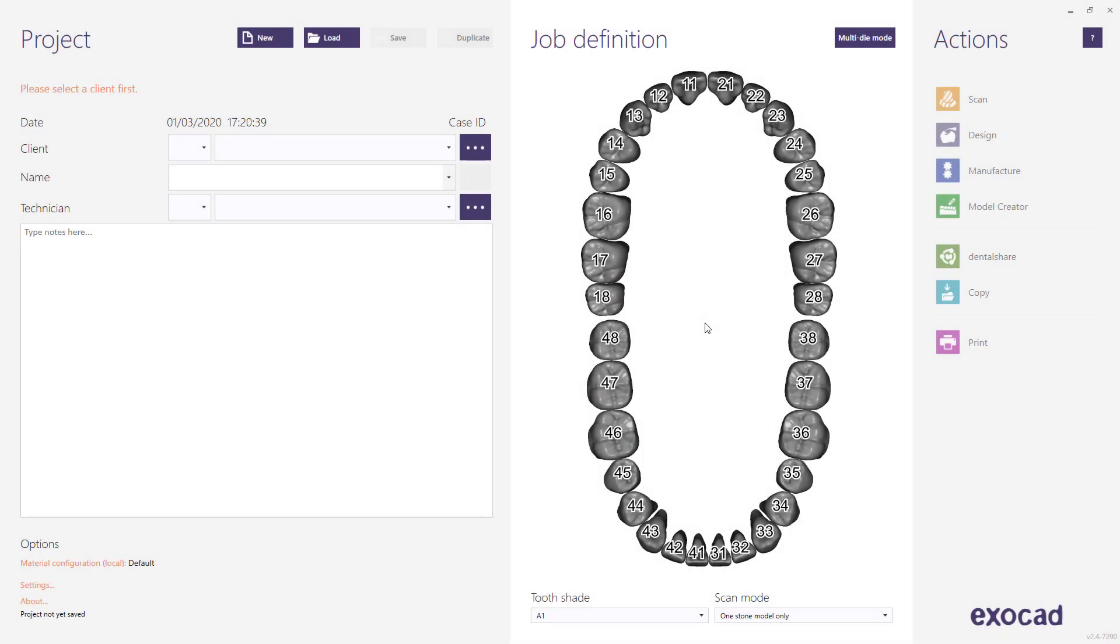This quick video tutorial from ExoCAD walks you through all the available FullDenture production methods including the various options and parameters.